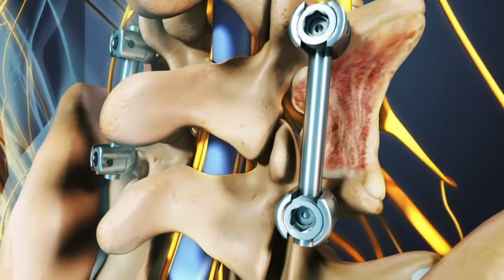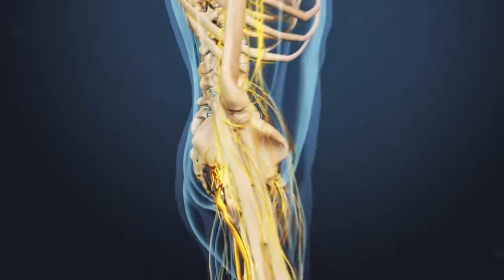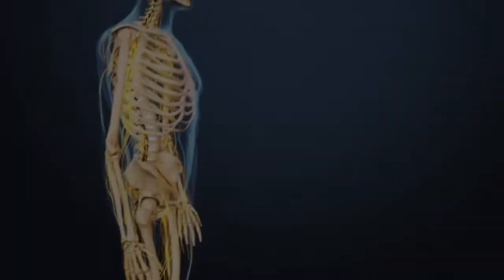Over the next several months, the body's natural healing response will help the bone graft and the adjacent vertebral bodies fuse into a single bone.